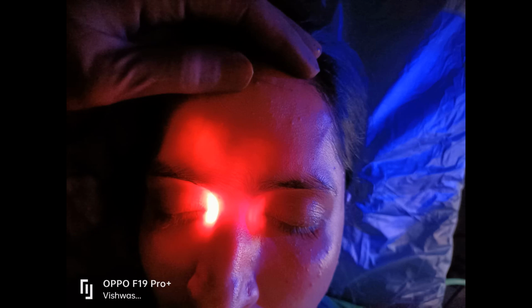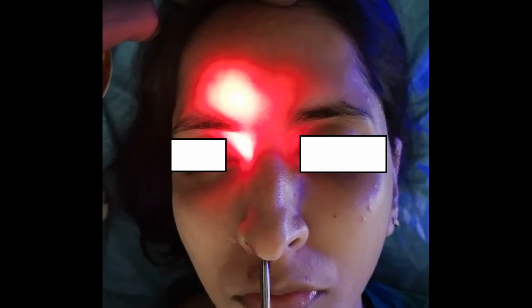So I'm going to shift on to the fourth photograph, and that is yet another photograph showing the frontal glow sign very clearly. So this is the fourth photograph under bright light from above, and you can see the bright reddish frontal glow sign inside the patient's right frontal sinus. And you can see the endoscope from the right nasal cavity entering inside.